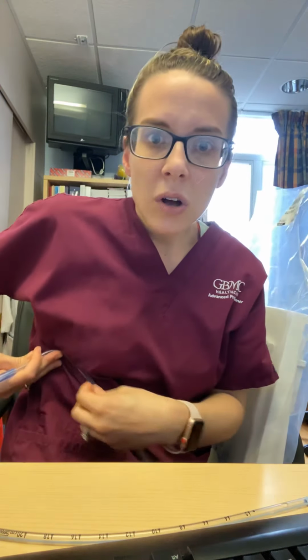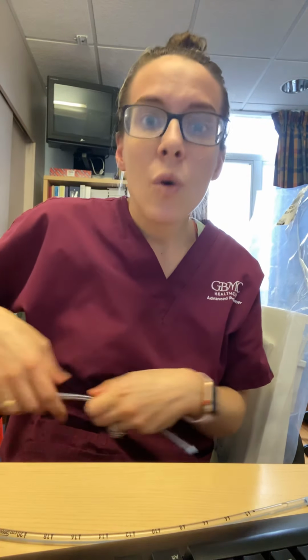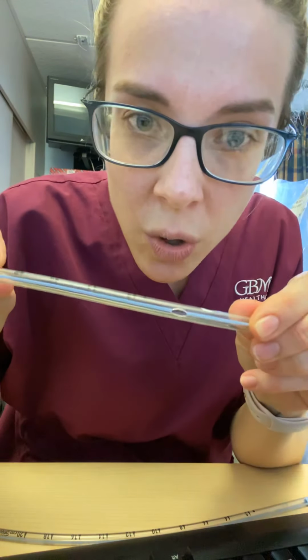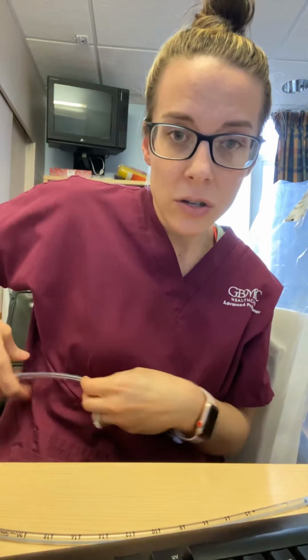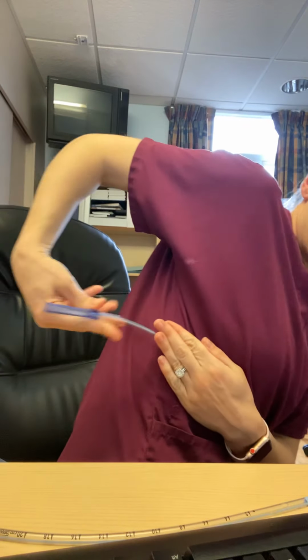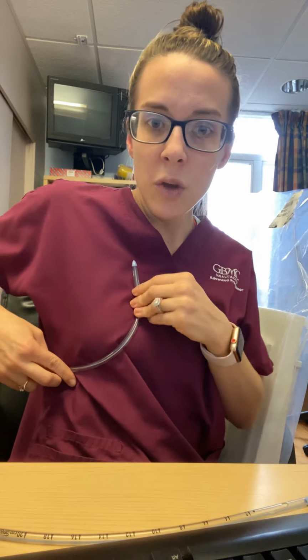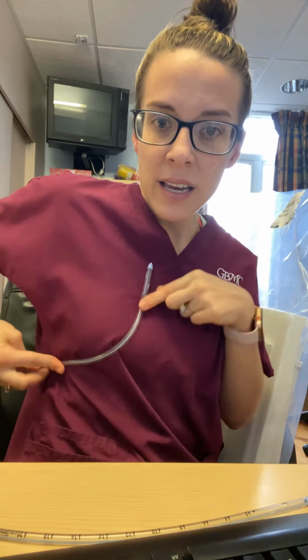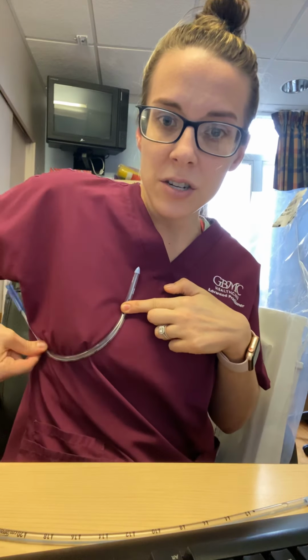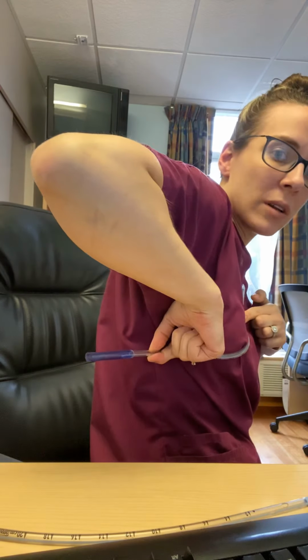If for any reason the nurse calls you up there and they're like, something's wrong with this chest tube, there's like a massive air leak, it keeps bubbling, one thing you can do is make sure that those drainage holes, you can't see them outside the skin surface. So this is what you'll see, and I'll show you the connector piece to the Pleurovac as well. Okay, so if this is in and you get a chest x-ray, you're basically seeing this piece that's internal in the pleural space against the lung, and this is out connected to the drainage box, which is called a Pleurovac.